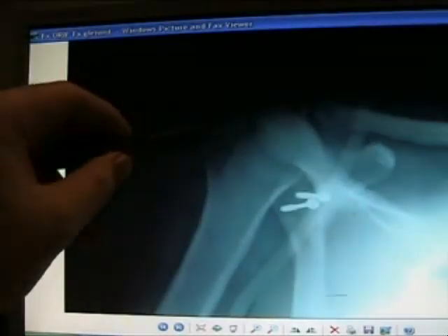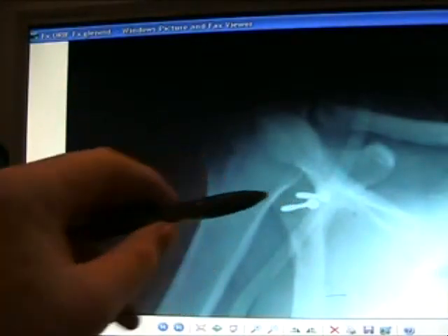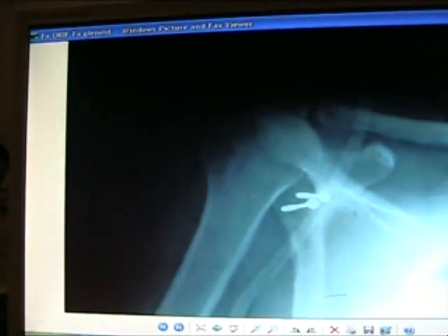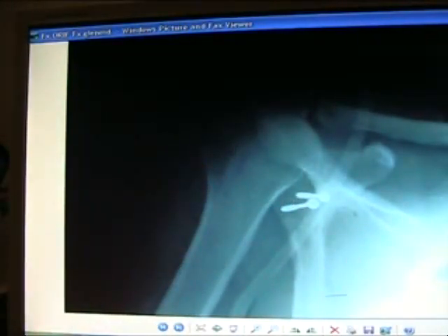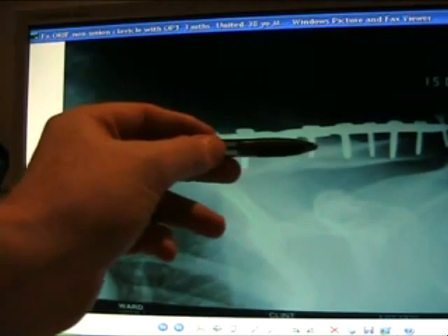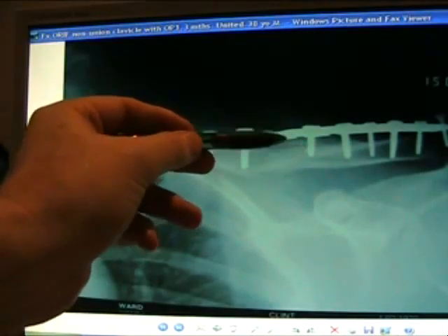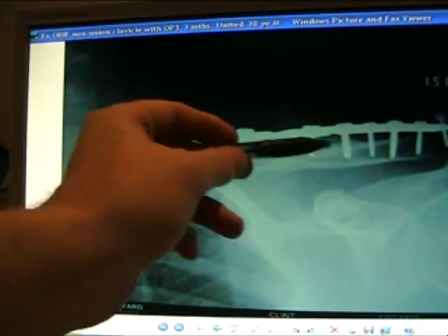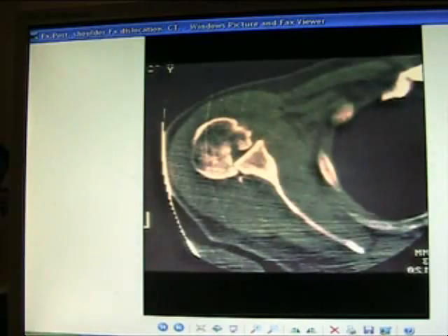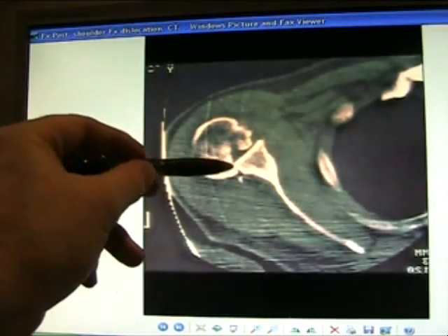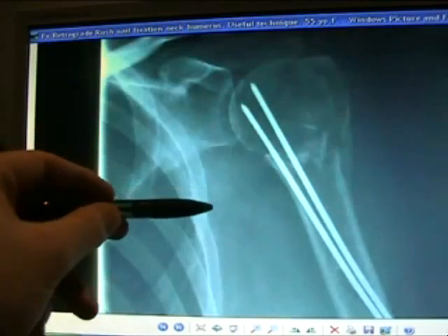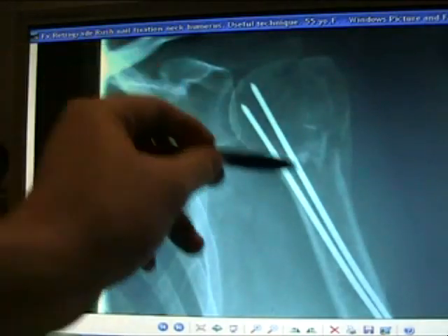Fracture of the distal clavicle — here's an open reduction internal fixation. Fracture of the glenoid — here's a fracture non-union fixed with a reconstruction plate and bone graft, which went on to union, in an adult. Posterior shoulder dislocation locked over the back of the glenoid — Rush pins used for fixing the fracture of the neck of the humerus.